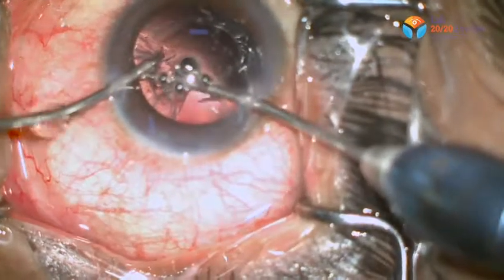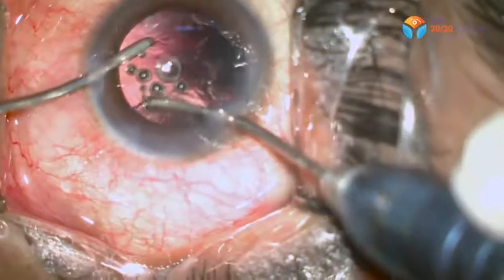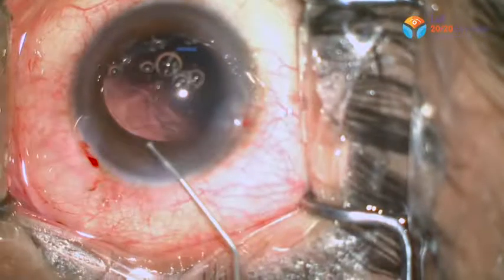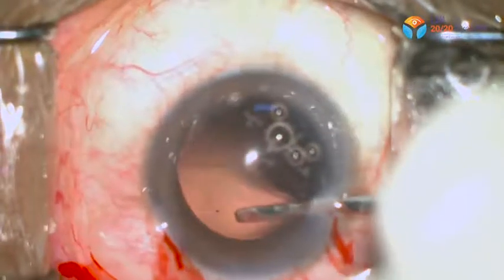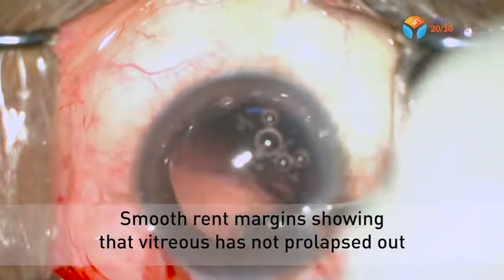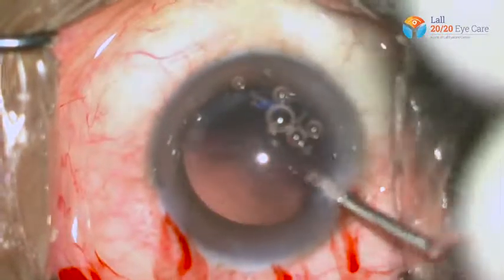The cortex was slowly removed from one quadrant to the other and finally close to the rent. After the complete removal, I put some more visco-dispersive, and now you can see here that we can clearly see the rent. Look at the edges. The smooth rent margins show that the vitreous has not prolapsed out. I am checking whether there is any vitreous strand coming out of the rent.